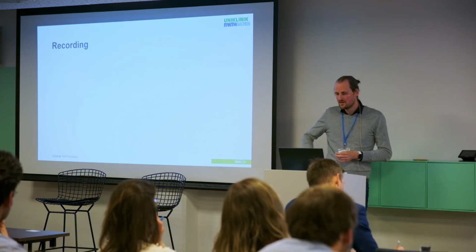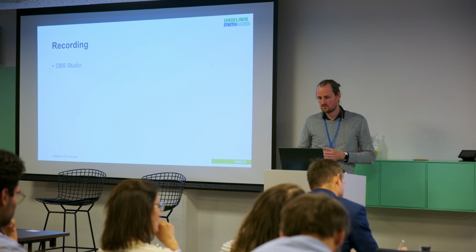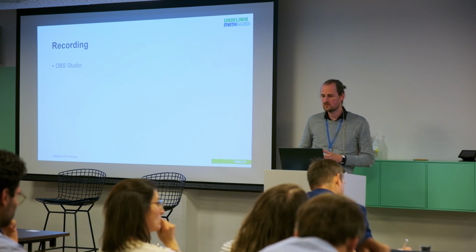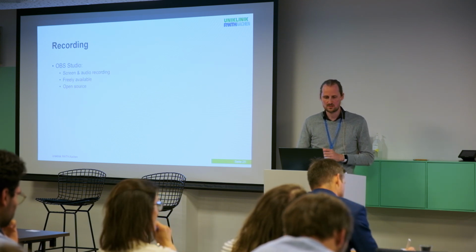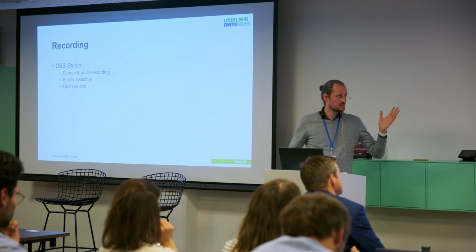And finally, we could even also record the entire conversation. So we wanted to record more than just audio. We used, in our case, OBS Studio. It's a screen and audio recording software, again, open source.